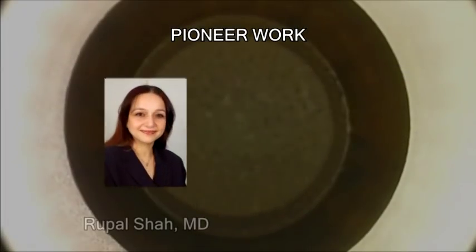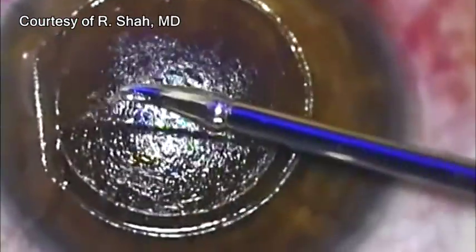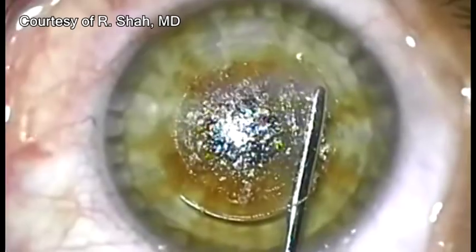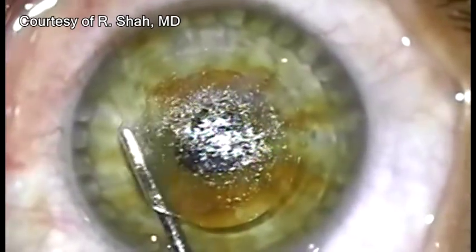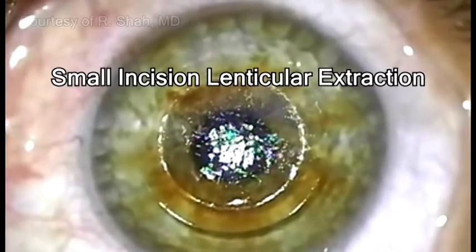Pioneering work by Rupal Shah and Walter Secundo initially involved making a flap to be lifted, exposing the underlying lenticule for removal. Improvements in the laser scanning and energy settings have allowed extraction of the refractive lenticule without lifting the flap through a progressively smaller incision, so that keyhole or small incision lenticular extraction was developed, or SMILE.